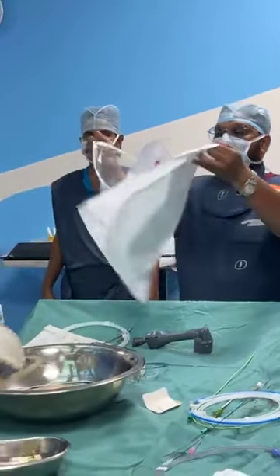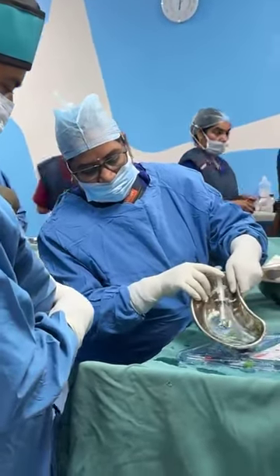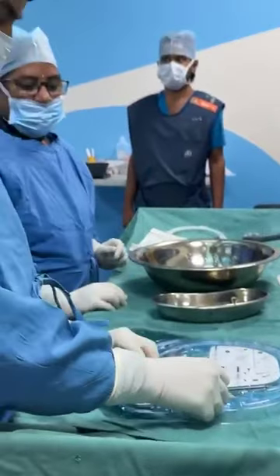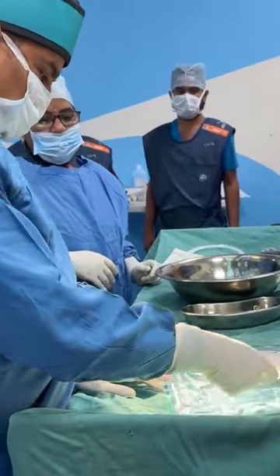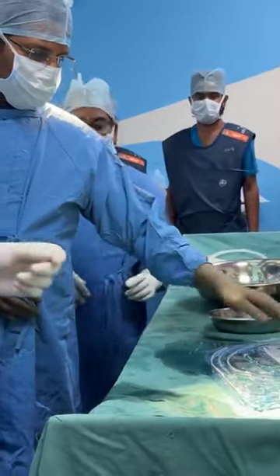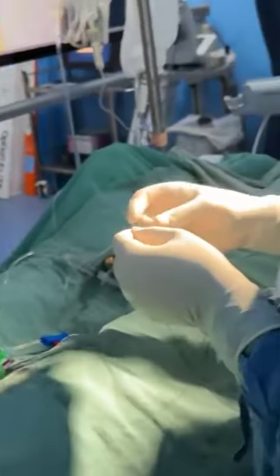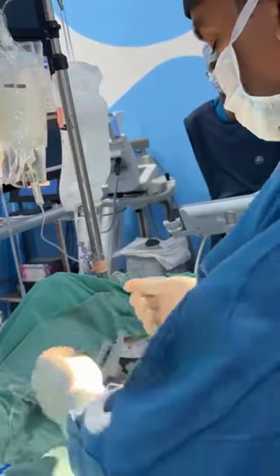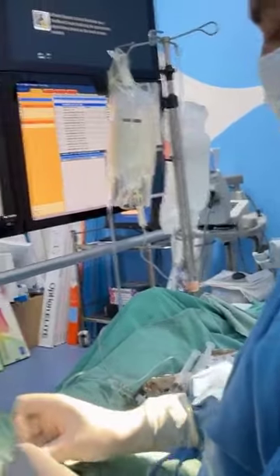There are multiple devices available to us. It can be a Spider, or an AngioGuard. It is going to be tricky, so don't expect it to be straightforward, because it's very, very critical. Carotid artery diseases are fairly common, and this is one of the common procedures that we do.